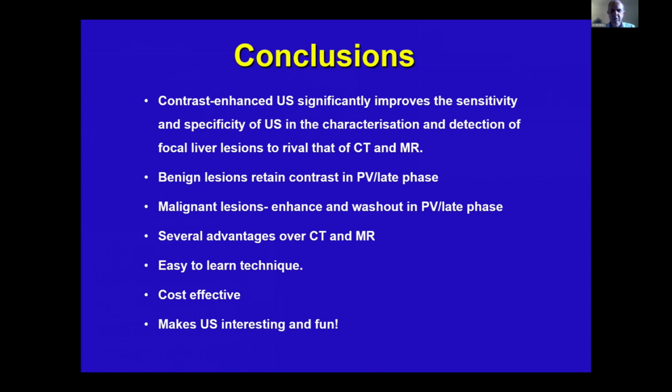There are numerous advantages of contrast ultrasound over MR and CT. Easy to learn technique, cost effective, and it makes ultrasound fun in that you can get the answer immediately, and more importantly, you can save the patient a lot of anxiety as they avoid a sort of 3-4 week wait for a CT or MR.